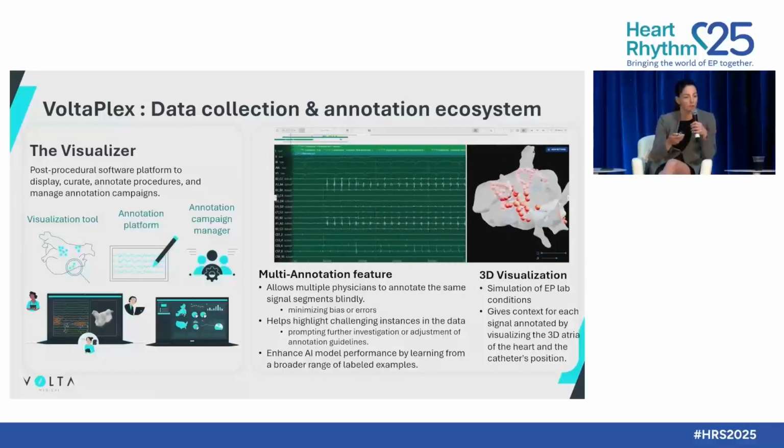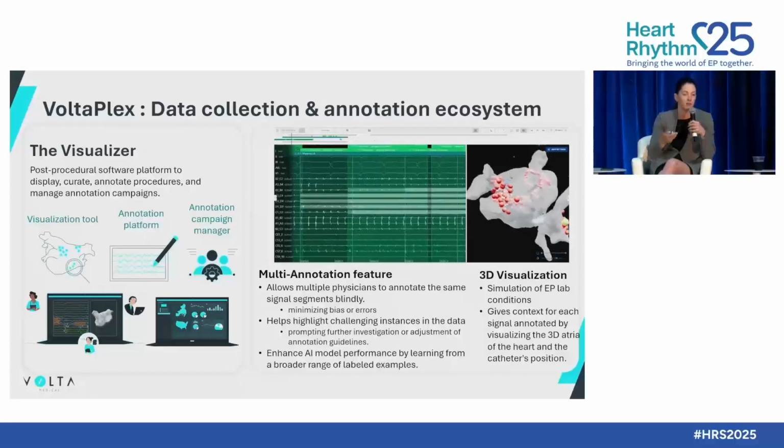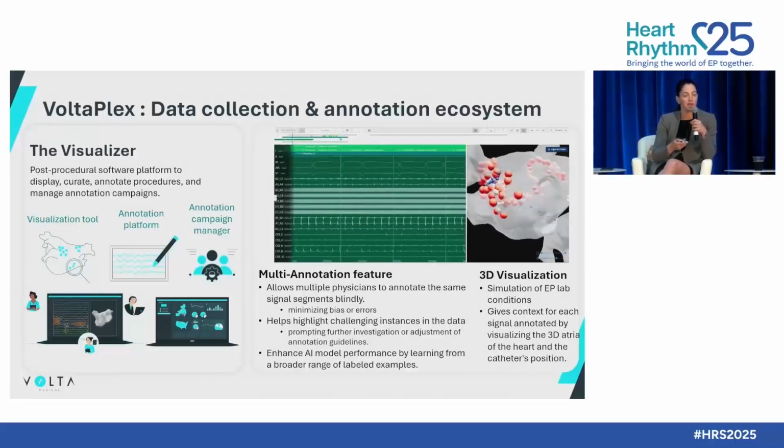It's a post-procedure software platform where you have all the data from the 3D maps, from the signals, from the annotations. But now you can sit down and have 10 other people, 10 other experts, annotate those signals as dispersion or not. Where were they?